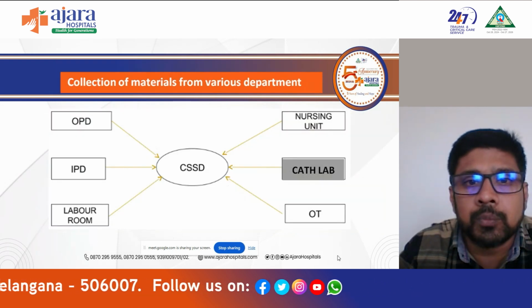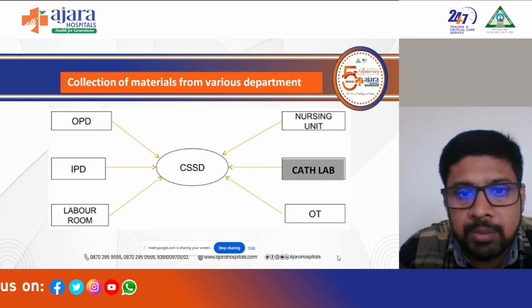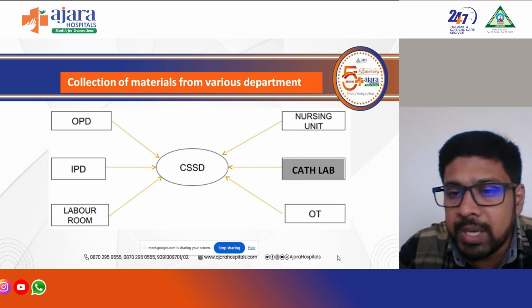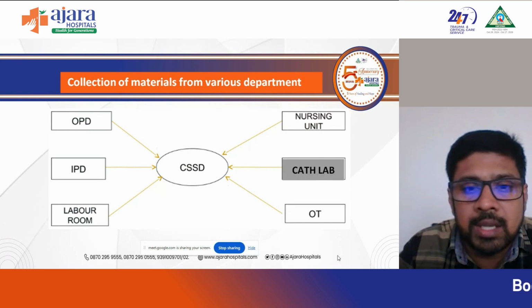This is the collection from various departments of the CSSD, where soiled instruments are coming from various departments: OPD, IPD, labor room, different nursing units, cath lab, OT, and all other departments. Wherever the instrument is used, it all will come into the CSSD for the sterilization and disinfection process.